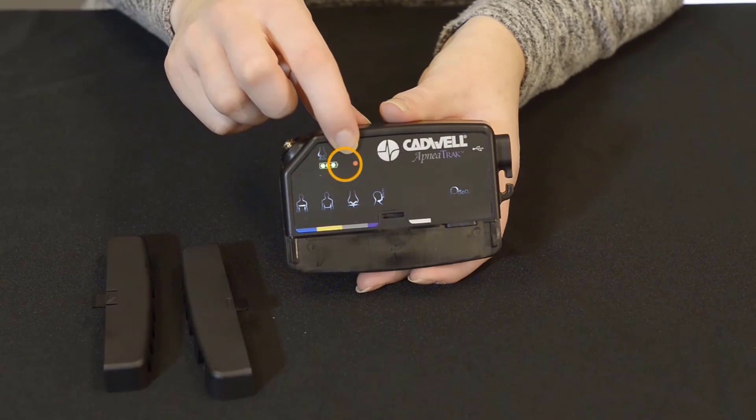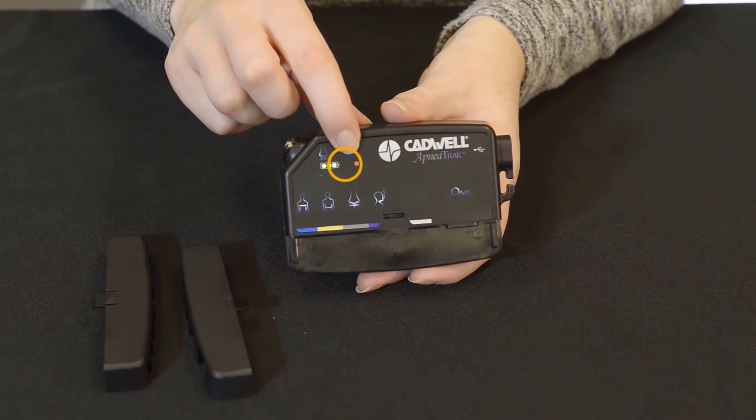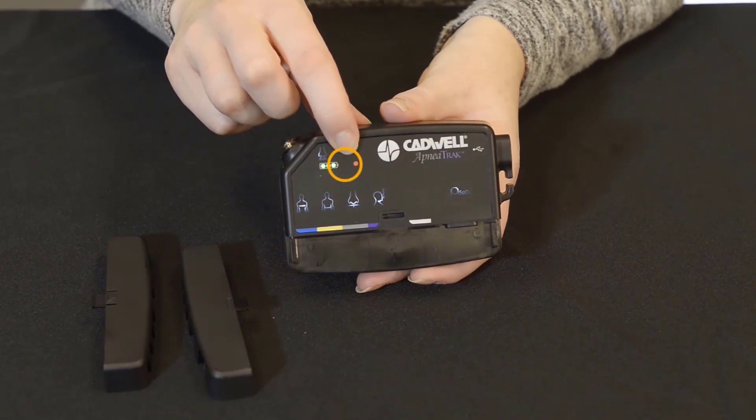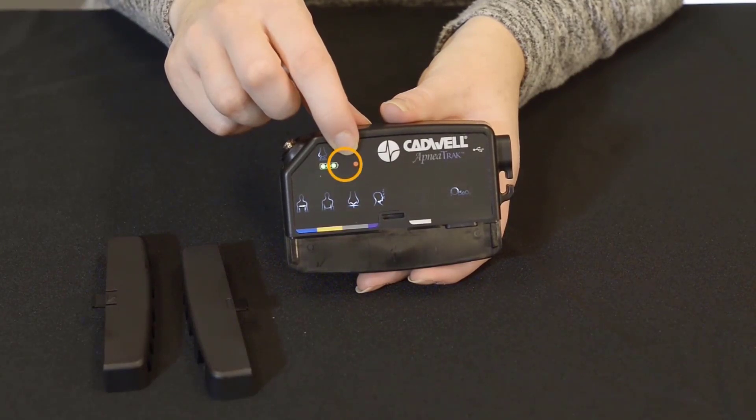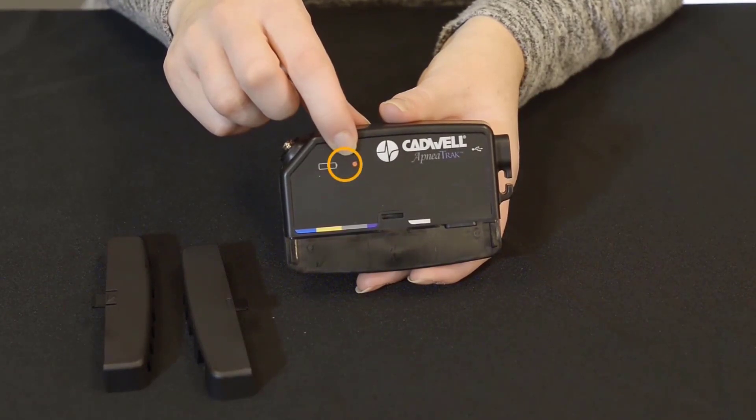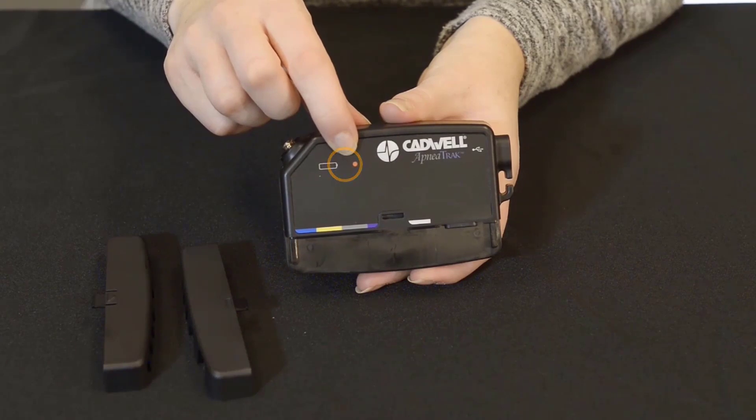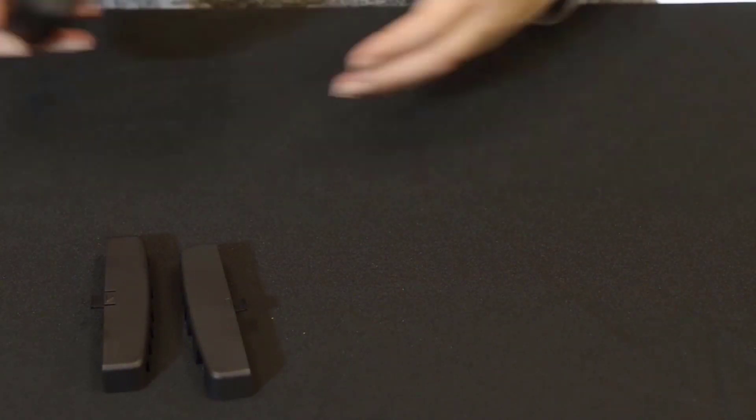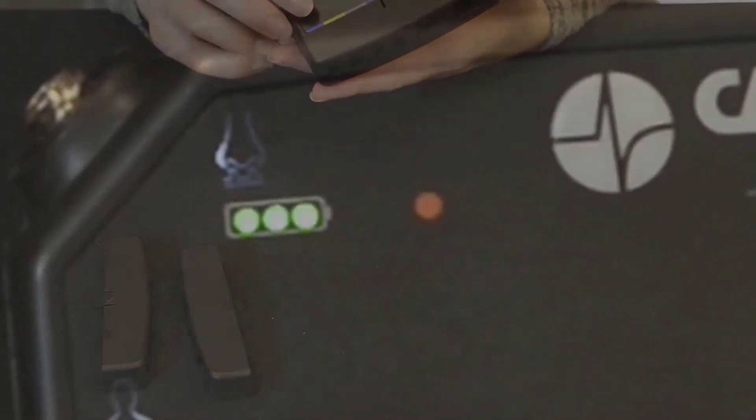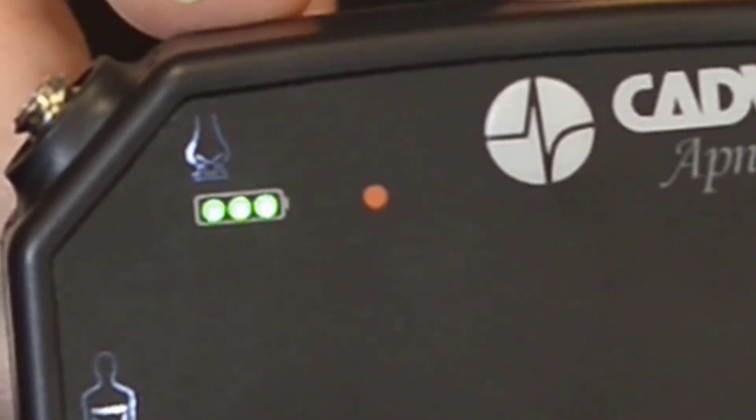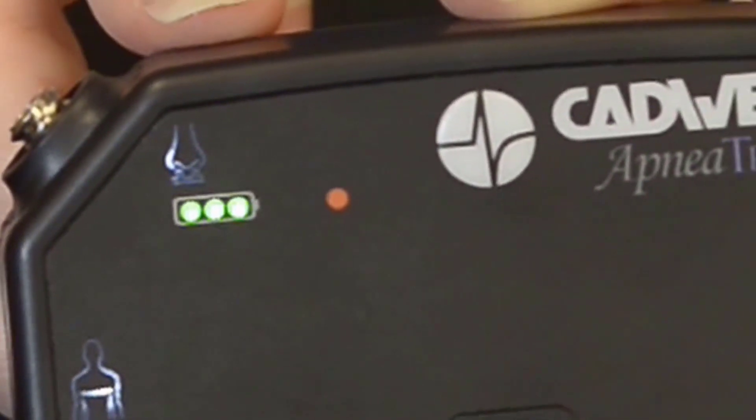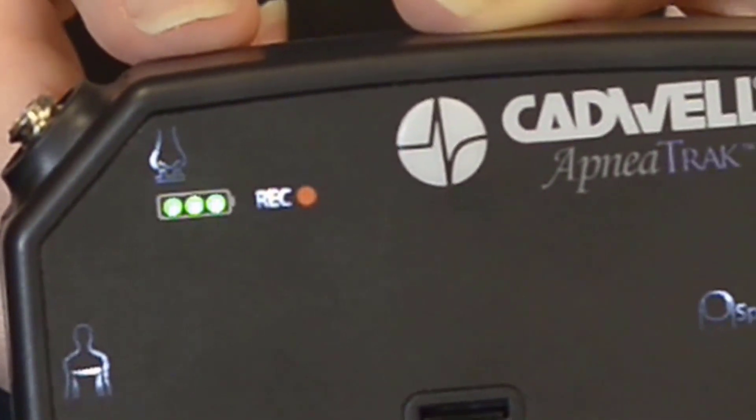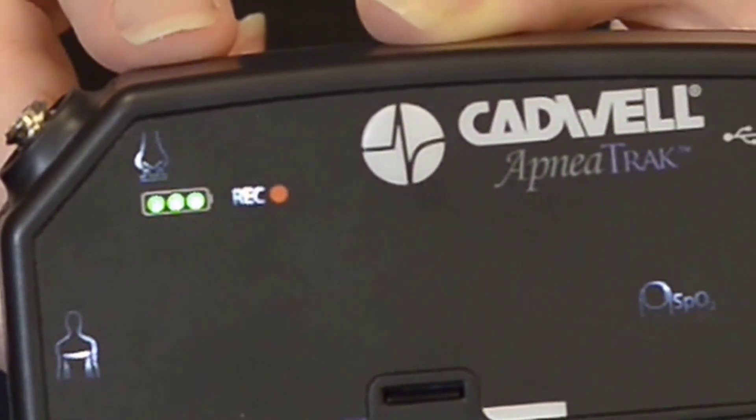If the device is in manual start mode, no indicator will be present between the battery LEDs and red dot. When the device is configured for a delayed start recording, the letters REC will slowly flash between the battery LEDs and the red dot.